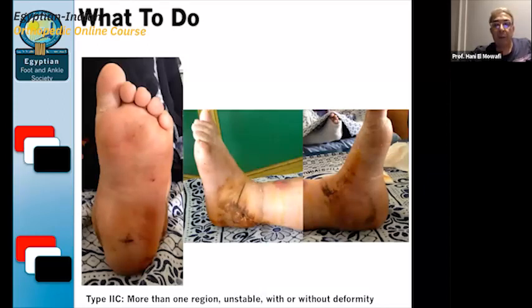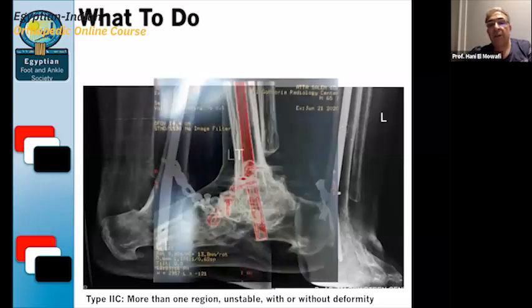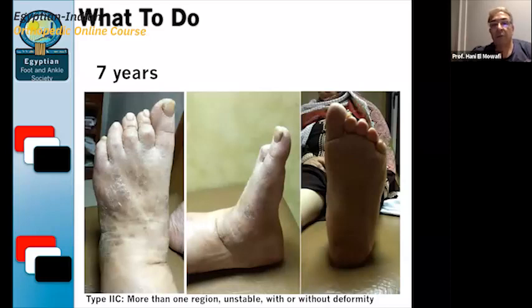And this is the patient's follow-up 6 months after the operation, and this patient called me and has some irritation. We see looseness in the screw, and this screw makes irritation when she wears shoes, and sometimes some irritation in front. But actually, the union is good, the quality of union is very good, and the patient has a stable foot, which is very important, and mechanically it's very good.